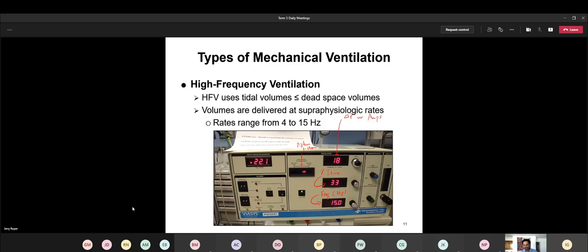And then this is the reset, which means that if the piston jumped off center for whatever reason and the machine stops, once you get the piston recentered, then you hit this reset button or reset power fail button, and then you hit the start, and then it'll start up again. But if that piston is not centered, I'm here to tell you, you're going to be sweating to try to get this machine to start up again.